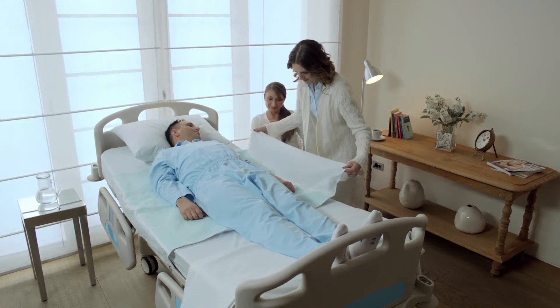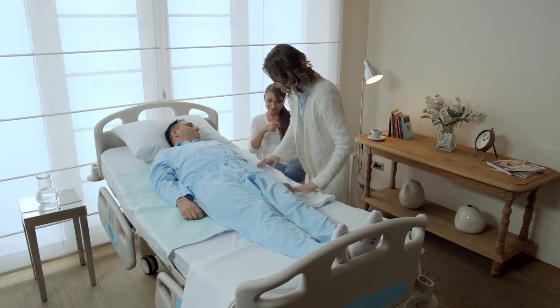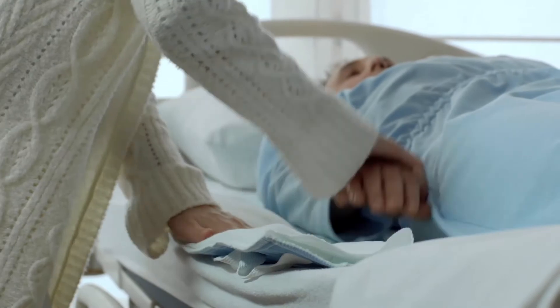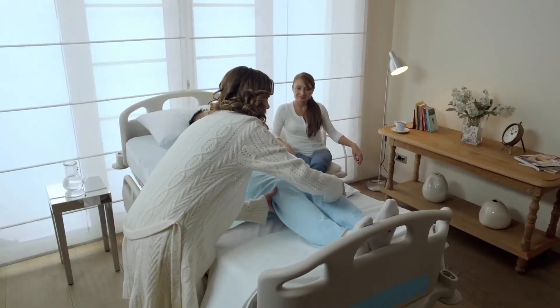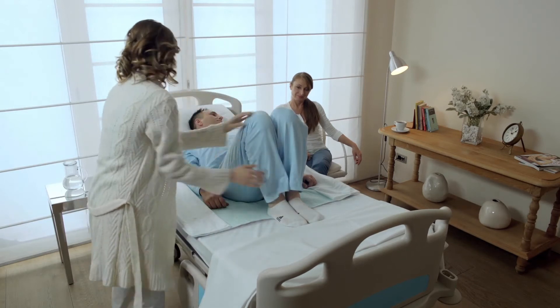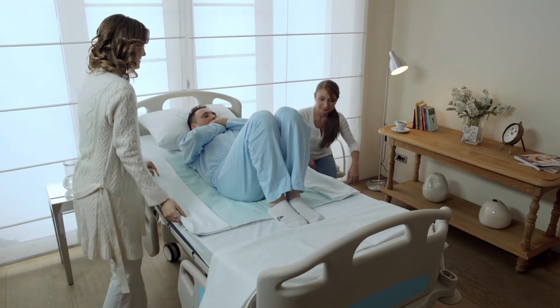Release the tuckings of AbsoSlide and put them up on the bed. Now the special handles under the tuckings will be at your hand level. The patient's knees should be moved to the chest and their feet must be placed on the AbsoSlide. The arms must be placed across the body at the chest level and the chin must be tucked in.